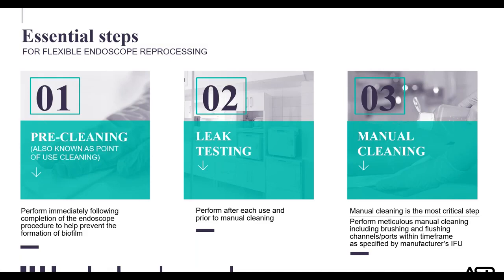So here we have a technician who's knowledgeable, but continues with the task even though he knows it's being done incorrectly. Remember in the previous slides talking about the tools and supervisions being factors that can be lacking for properly reprocessing these flexible scopes. The steps to reprocessing any flexible endoscope are complex, but they're essential. So let's walk through some of them.